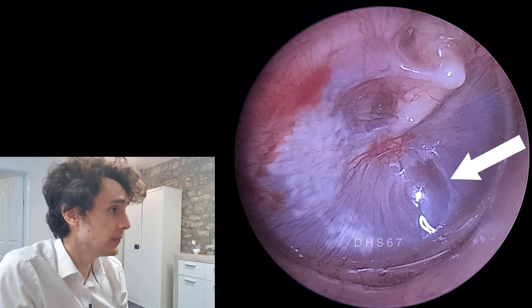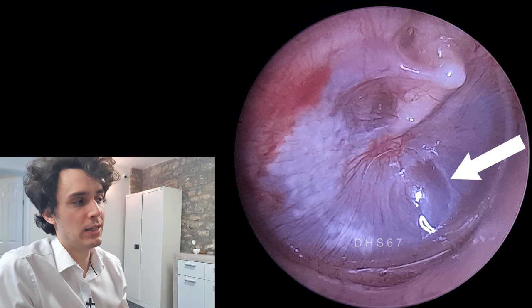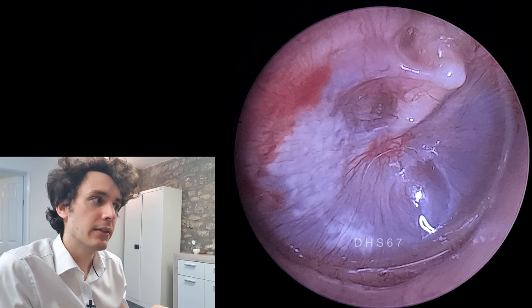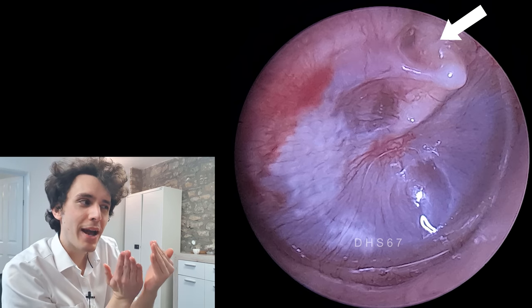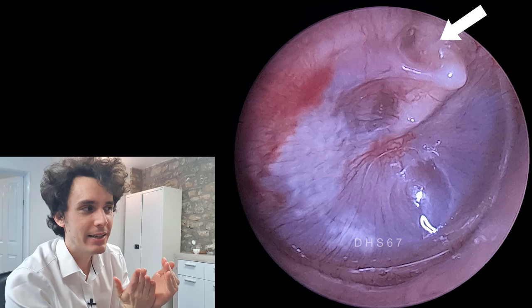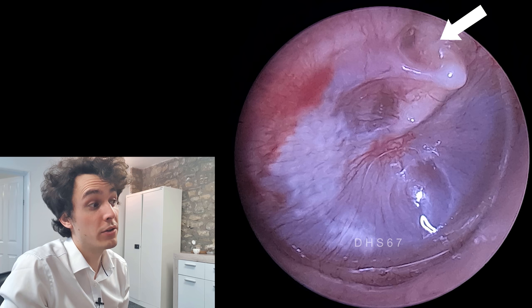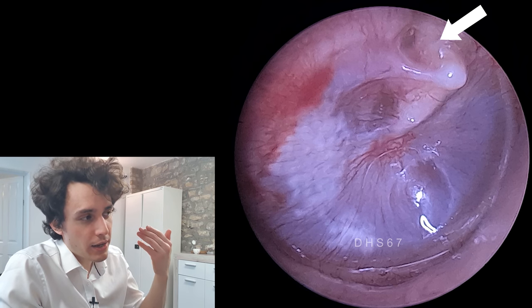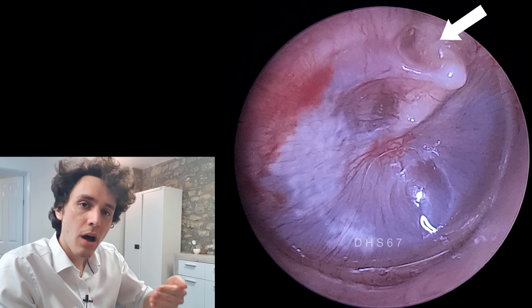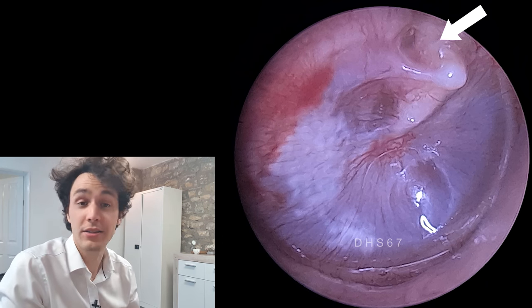The other thing to note about this eardrum, which is a bit more subtle, is that it is slightly retracted. You can see near the handle of the malleus — the eardrum's kind of wrapped around the handle of the malleus a bit tightly. That's a very subtle sign that the retraction is back. So now that the grommet has fallen out, there is a negative pressure starting to build behind the eardrum again — clearly the eustachian tube dysfunction is still there.